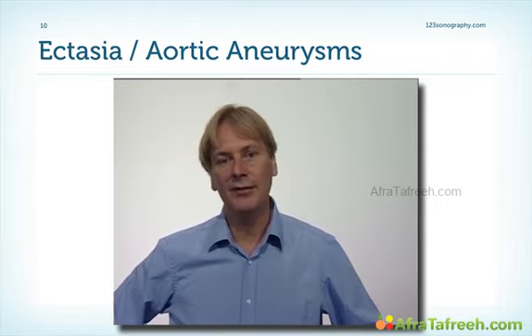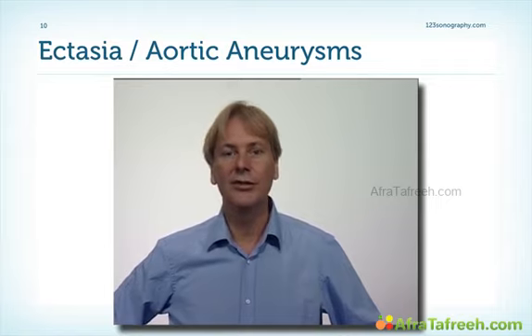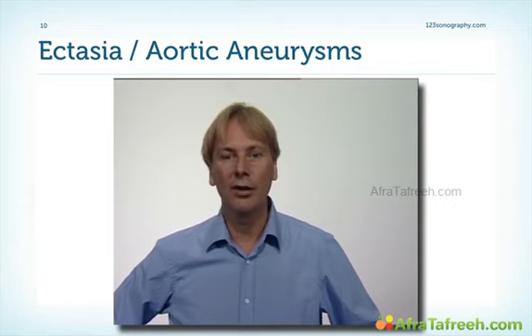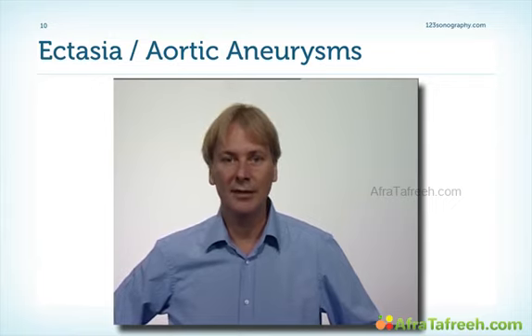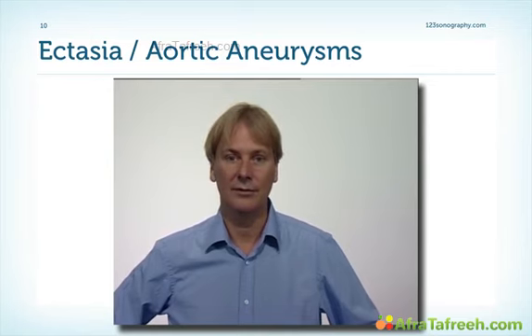And if you have patients who have such massive plaque, you can assume that this is only a general marker of atherosclerosis and that the other vessels are equally affected. Very often we have an association with coronary artery disease. But now let's turn to the next topic, the topic of aneurysms and what we can see with echo.